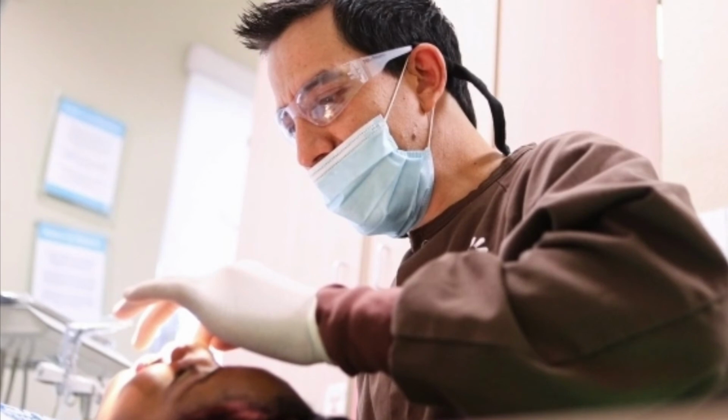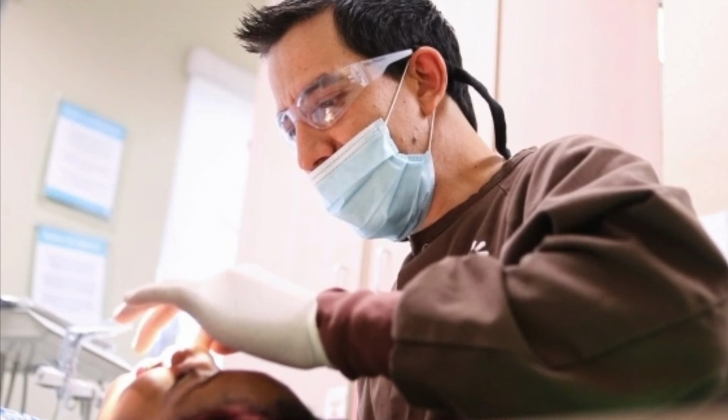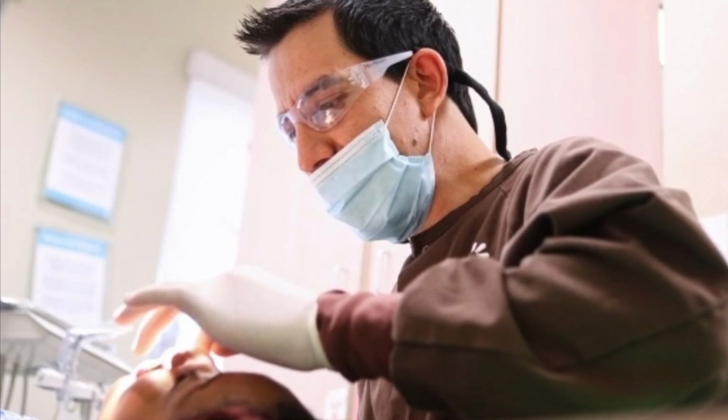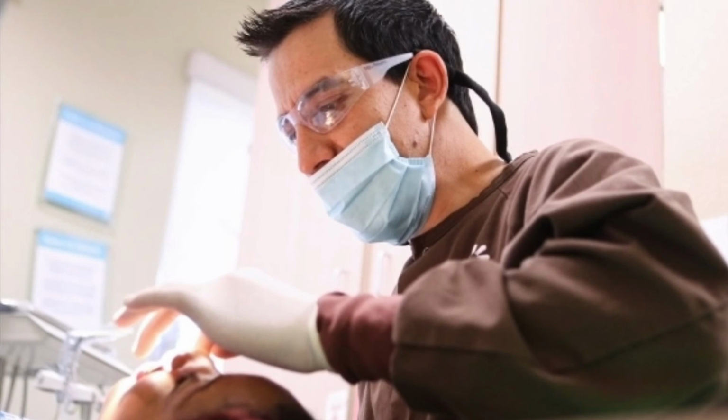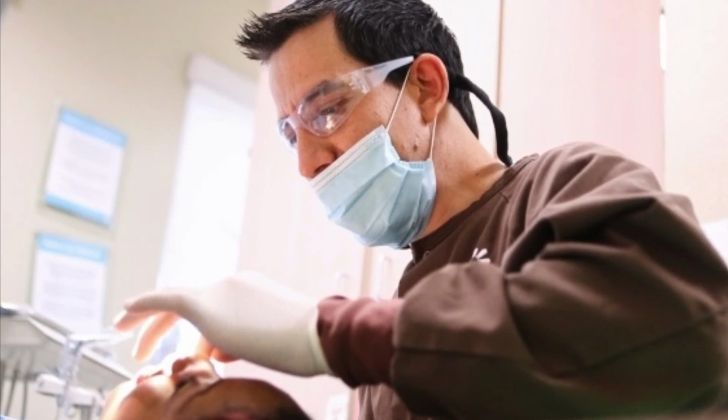Group 3, and there are group 4 engine-driven instruments that adapt themselves three-dimensionally to the shape of the root canal. Like other nickel titanium instruments, they adapt to the shape of the root canal longitudinally, but additionally, they also adapt to the cross-section of the root canals. There is currently only one instrument in the group, the self-adjusting file.